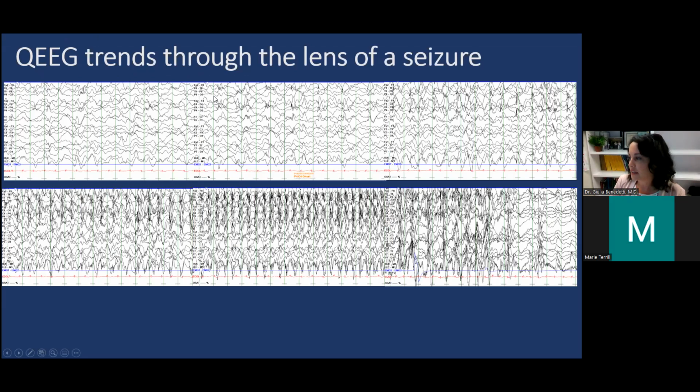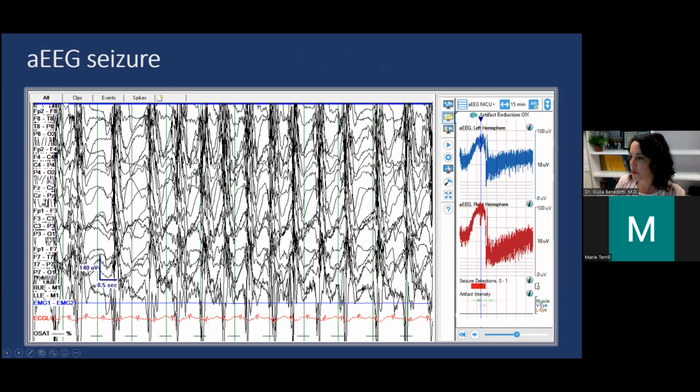This is a seizure starting over the right hemisphere. You can see at onset there's rhythmic delta activity, slower activity, but there's overriding fast activity. Then the waveforms get faster and they get higher amplitude. And then at offset, you're going to get slow 1 Hertz rhythmic discharges. So for an amplitude integrated EEG, this is, again, an amplitude-based trend.